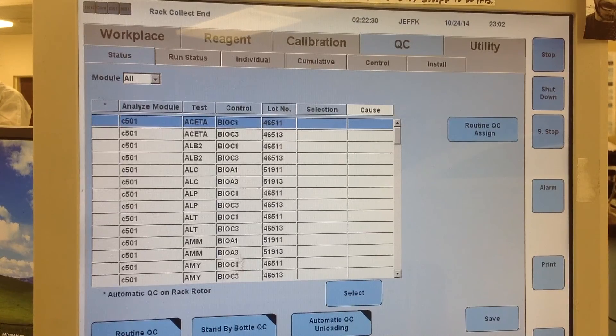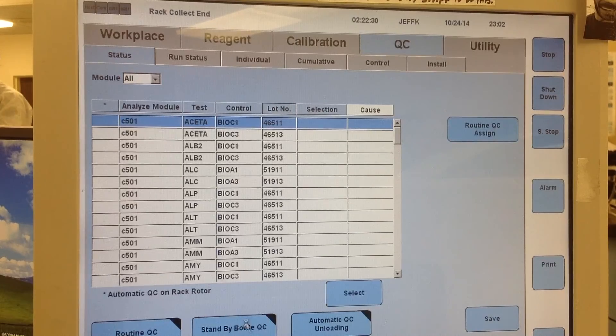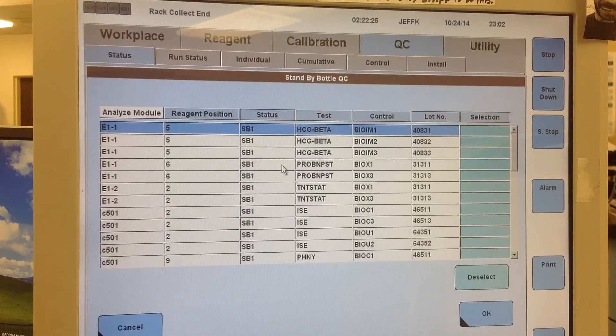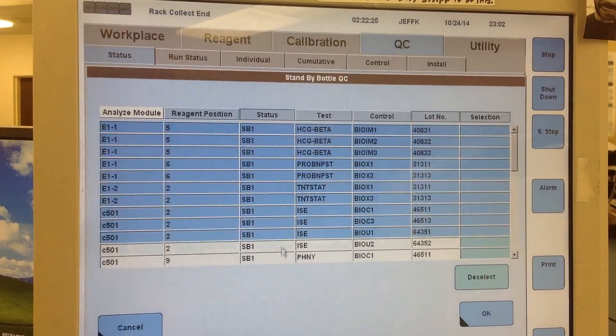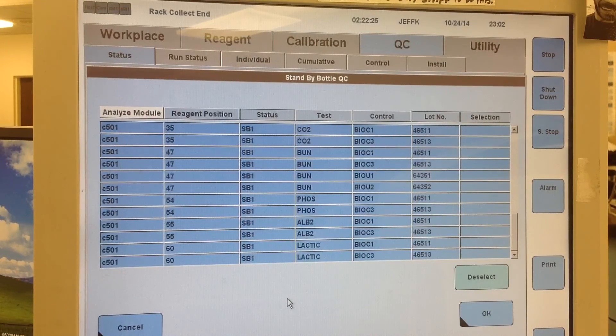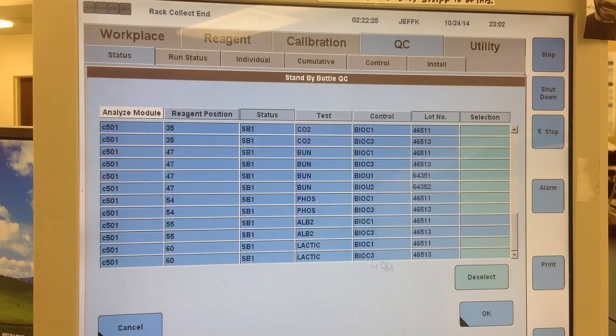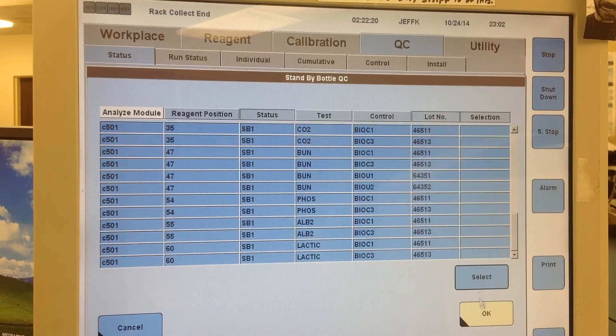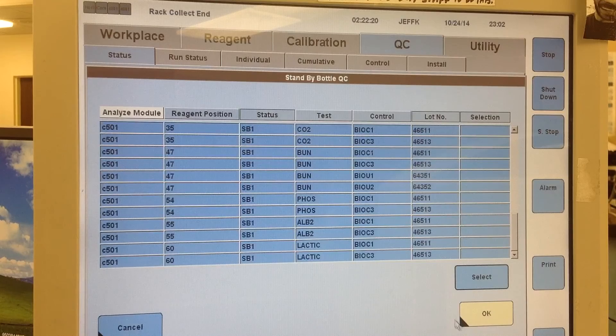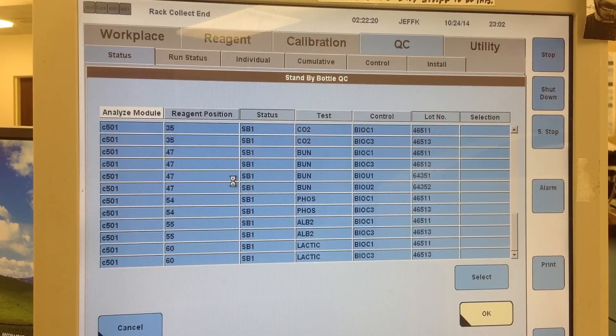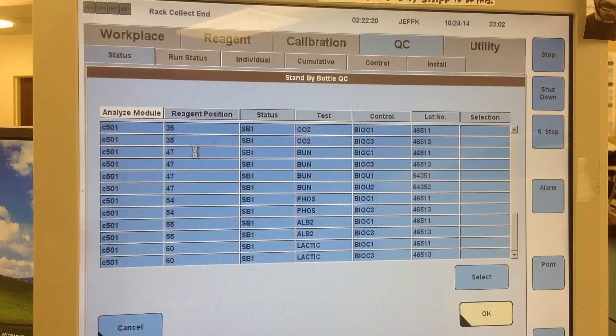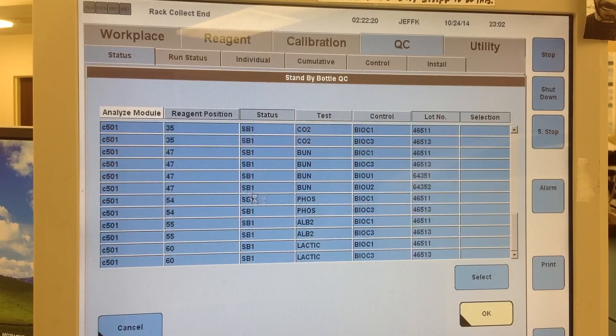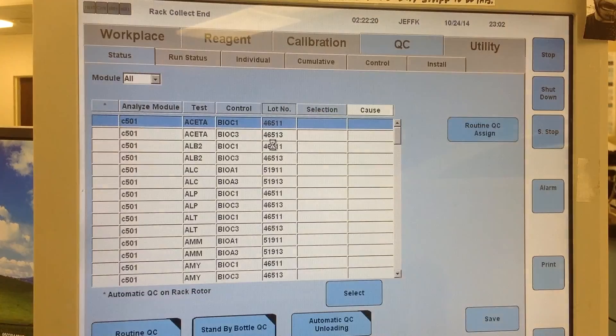You can select standby packs by going to the standby bottle QC. I have all these ordered from earlier, so I'm going to unorder them by highlighting everything, clicking deselect, and then OK, and that will unorder all the QC in my standby packs.